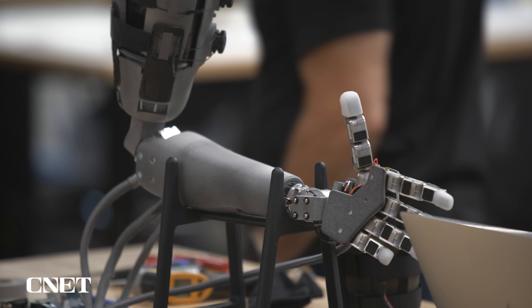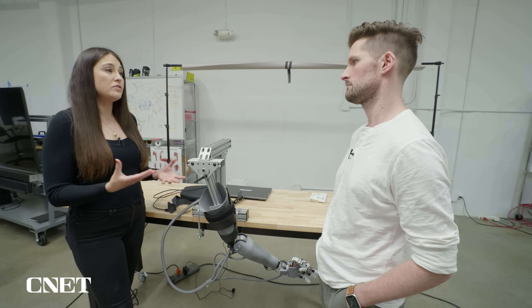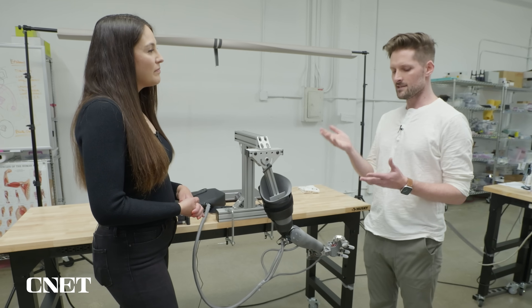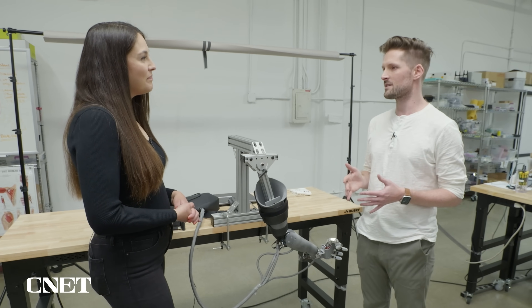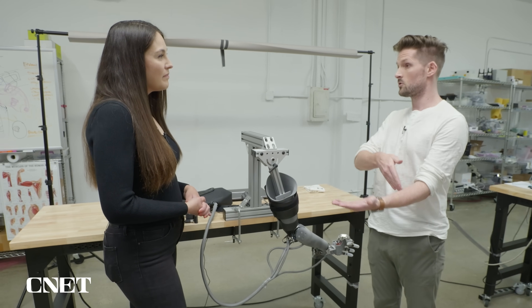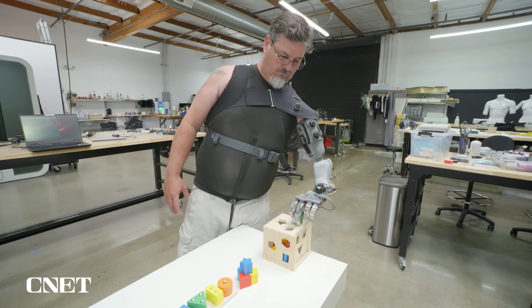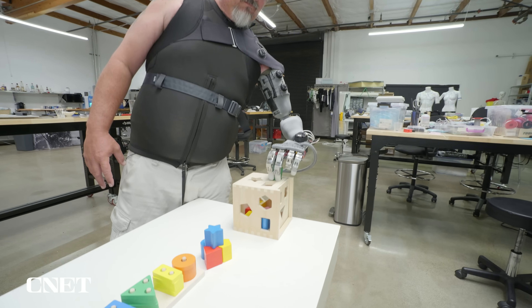The most meaningful thing is as much control as we can restore — muscle control, motor control, and sensory feedback. What can you really not do right now? Writing cursive, playing a piano — that's really fine motor control. At some point these neural interfaces have to get a lot better, so that might mean going into the body, it might mean more electrodes. But regardless, the more control and sensation we can restore, that's the most meaningful thing.